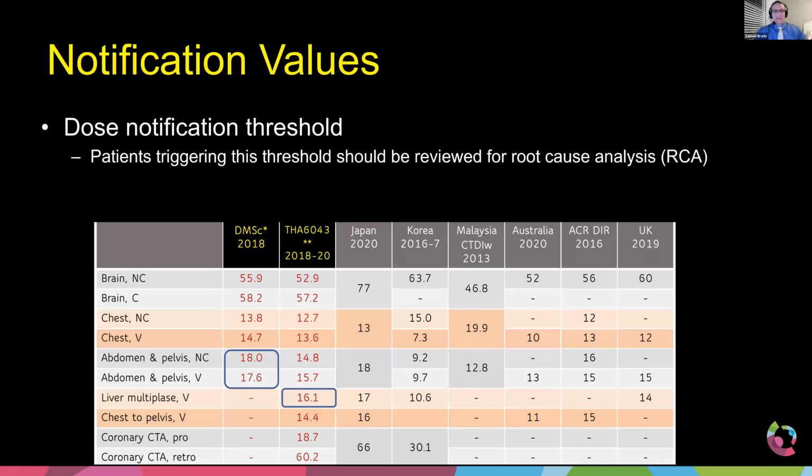But even though, yes, this might be a small percentage from a few academic centers more locally, I still think it's really impressive, because most places, in the European and Australian around the world, most places haven't quite figured this out either. So CTAs, you don't do as many cardiac CTAs as you do abdomen pelvis. So you'll never have a lot of data, but collecting what you have, that's a great starting point. So I think that's just kudos to you guys for collecting this data.